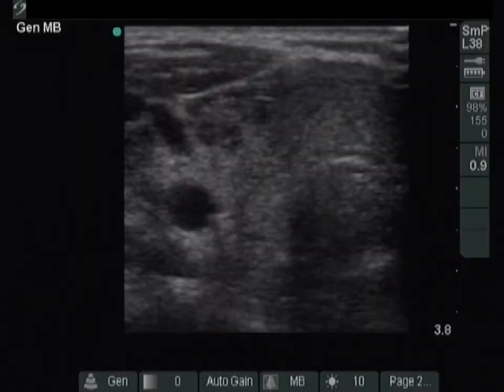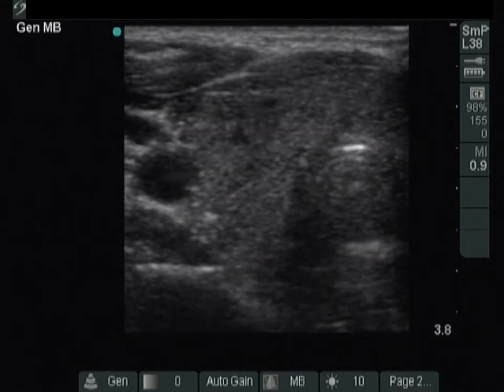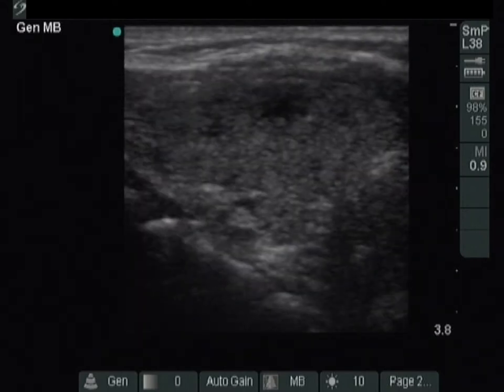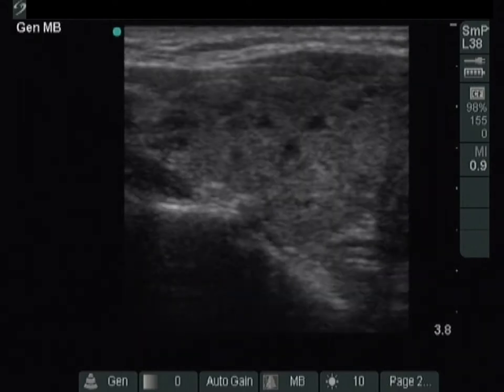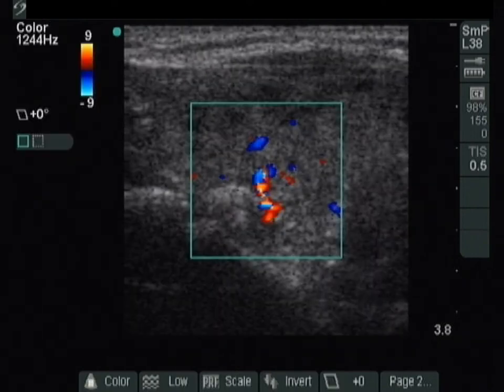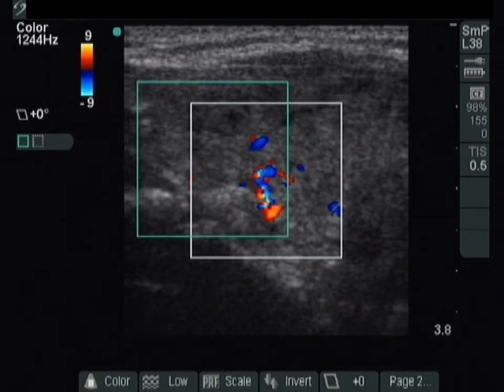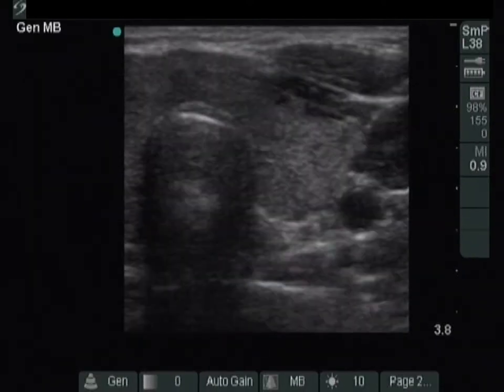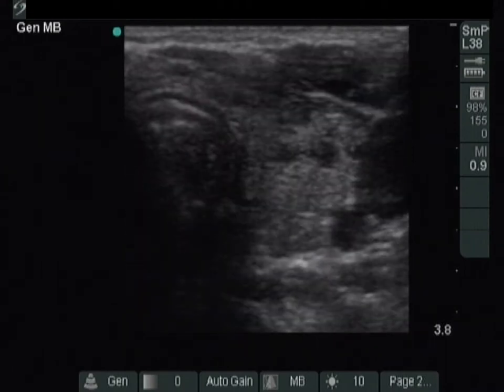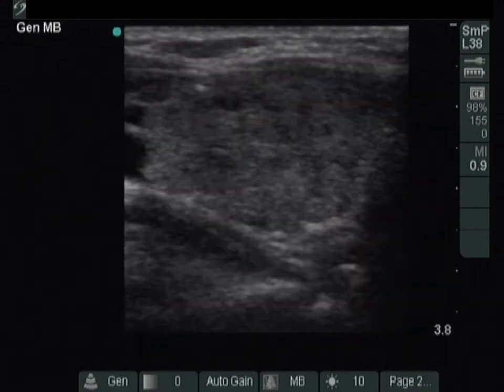The right lobe is echoabnormal and contains hypoechoic areas. The echogenicity index is around 15%. The left lobe has a similar appearance. This pattern corresponds to Hashimoto's thyroiditis.